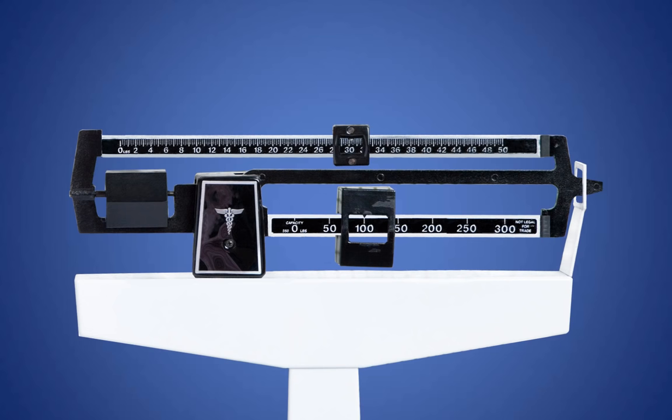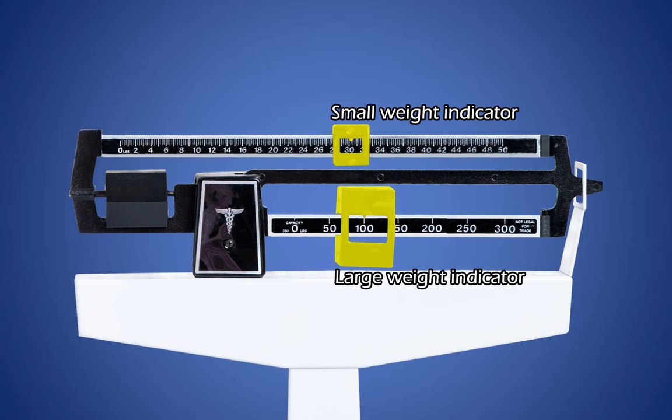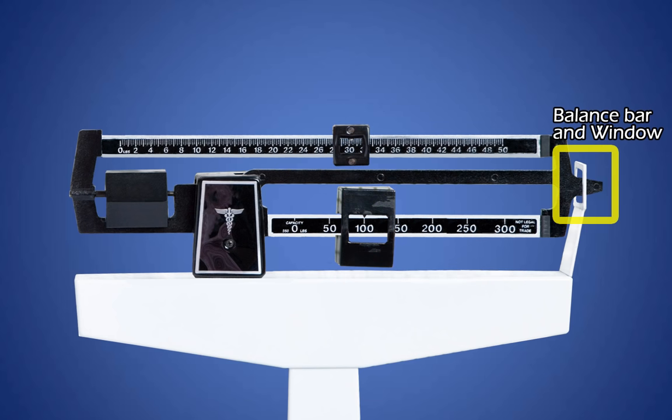The parts of the Physician Mechanical Beam Scale that we will focus on today are the balance beam which includes the upper and lower poise bars, the poise weights also known as the large weight indicator and small weight indicator, and the balance bar and window.